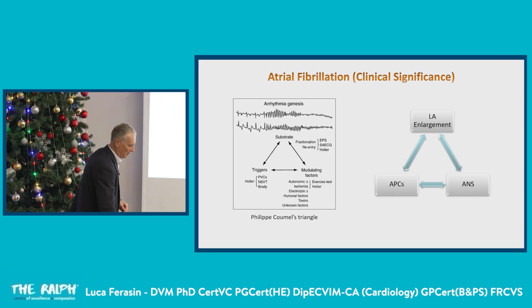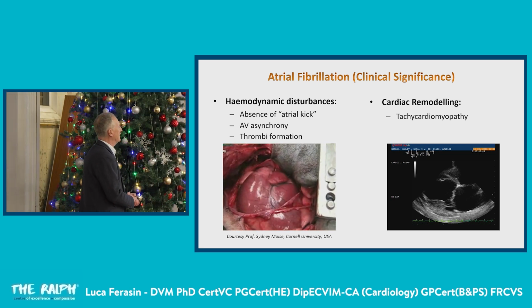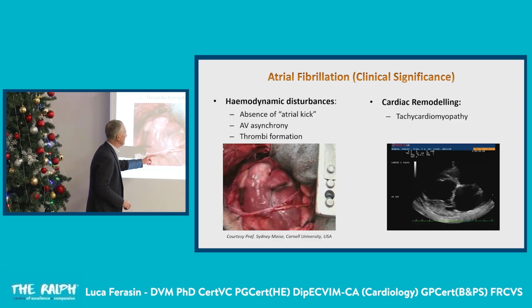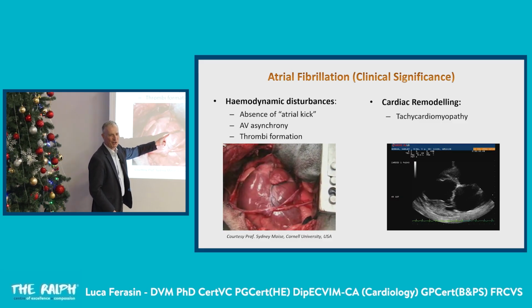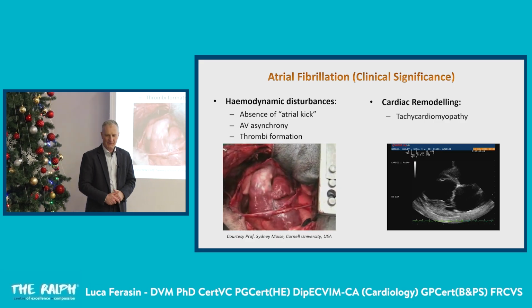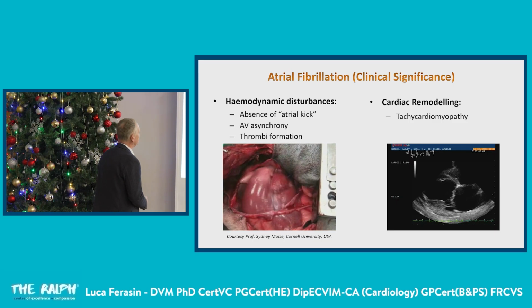Right. I've got beautiful videos here from an American colleague called Sidney Moise, a real expert in arrhythmias. And here, they were doing a pericardectomy. Look at the atrial fibrillation, how the atria are contracting compared to the ventricles. Isn't it beautiful? It's beautiful to see on ECG, but even more convincing when you see it on a heart beating in front of you.